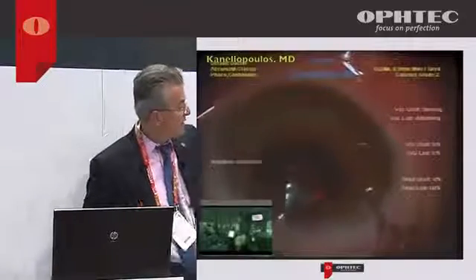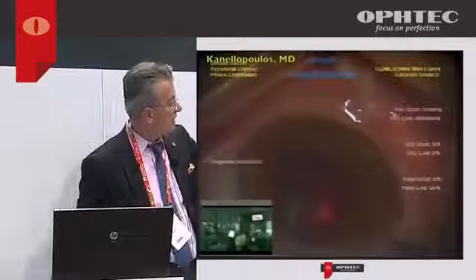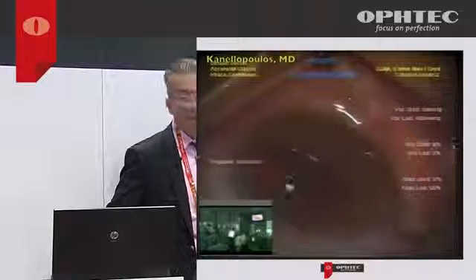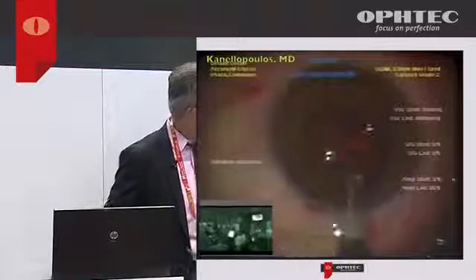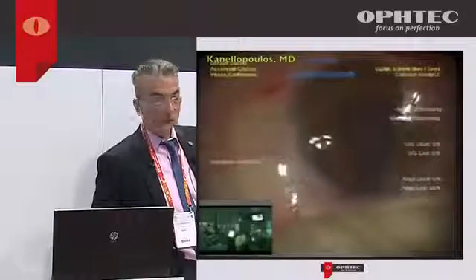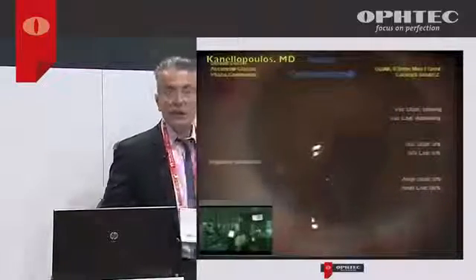The learning curve is to estimate. In the beginning, a lot of surgeons mark, if let's say they enclave the lens here, they will mark the diametrically opposite side to guide them to enclave on the diametrically opposite side. Because if you enclave a little bit further outside that, then the lens will be displaced either superiorly or posteriorly. So in the initial steps, it does make sense once you achieve your first enclavation to just step back for a second, see what's the diametrical opposite side, put a marking here, and then use that as a guide.